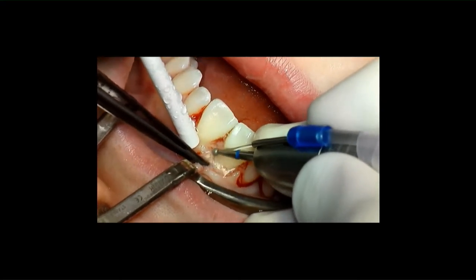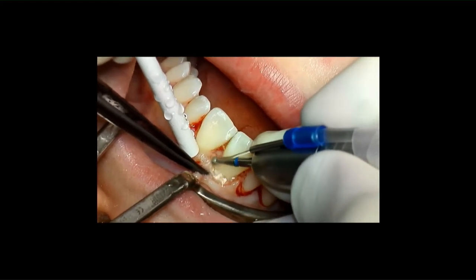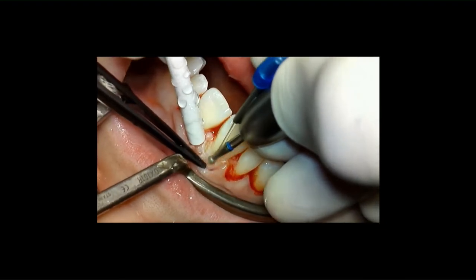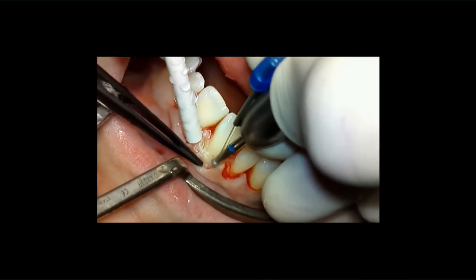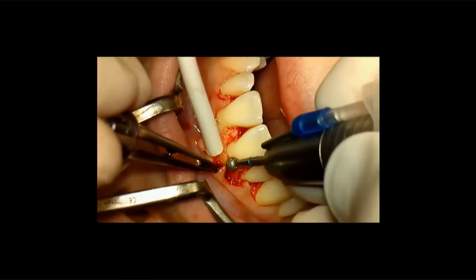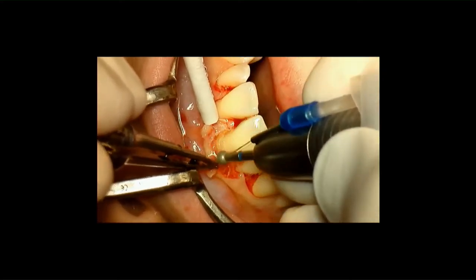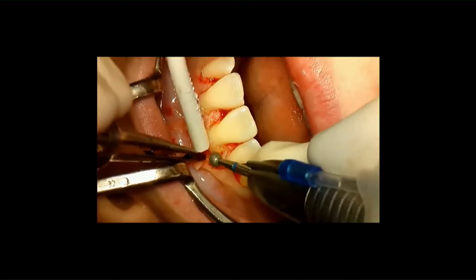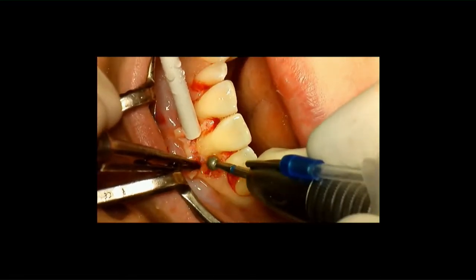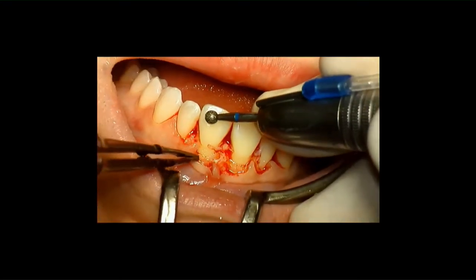I do this tooth by tooth, taking the guide on and off to constantly have a good measurement and a good reference point to work from. In many of the cases I did previously, I did not reduce the thickness of the remaining bone, and the cases did not look very good afterwards. So you really need to thin out the buccal bone on every single tooth that you do this procedure on. Highly recommended.